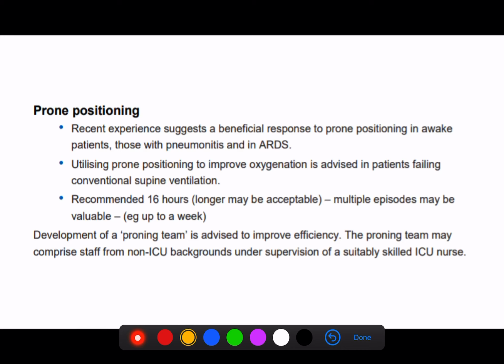And one key thing, if you are proning patients, always make sure that you put them into a reverse Trendelenburg, i.e. the head is above the level of the heart. It'll drain away a lot of the lymph and therefore reduce a lot of that facial swelling. Because if you get an accidental extubation of these patients, it is a nightmare trying to intubate a patient with laryngeal edema.